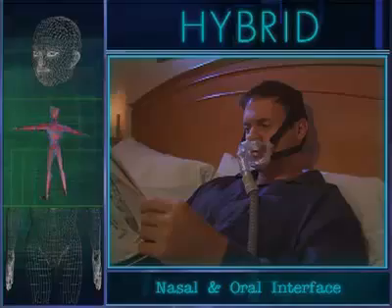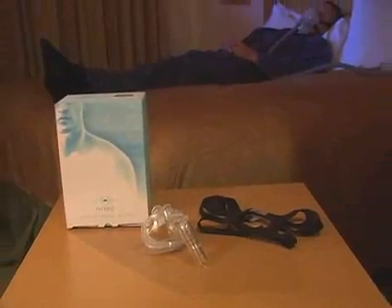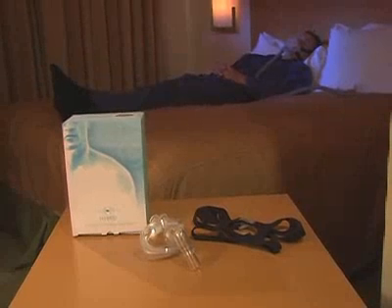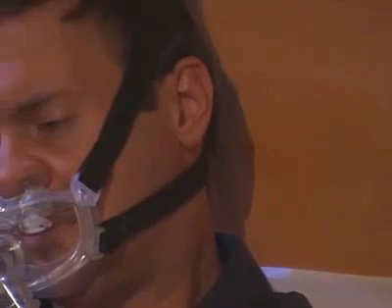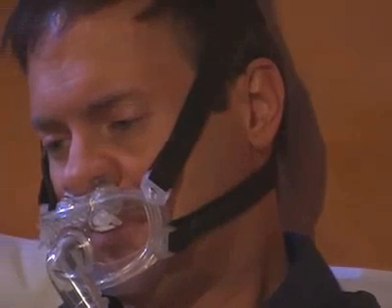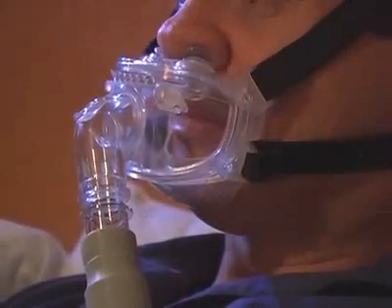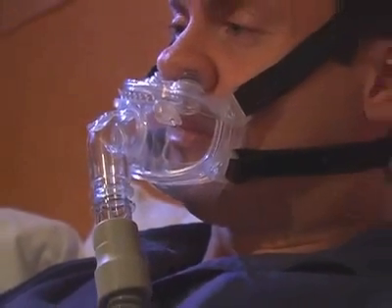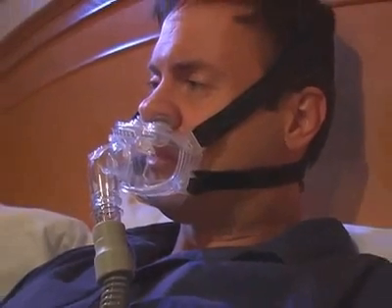The hybrid is an interface for positive pressure ventilation devices for the treatment of respiratory insufficiencies and obstructive sleep apnea. The unique design of the hybrid promotes patient comfort by eliminating pressure points on the forehead and across the bridge of the nose. A built-in chin flap gently supports the chin, ensuring optimal performance.